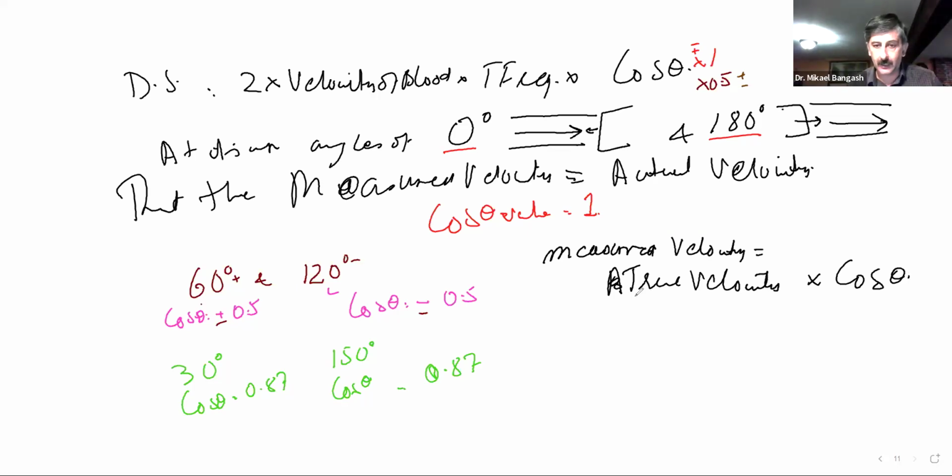What is meant here by the true velocity is what we said in our Doppler equation, the velocity of blood.